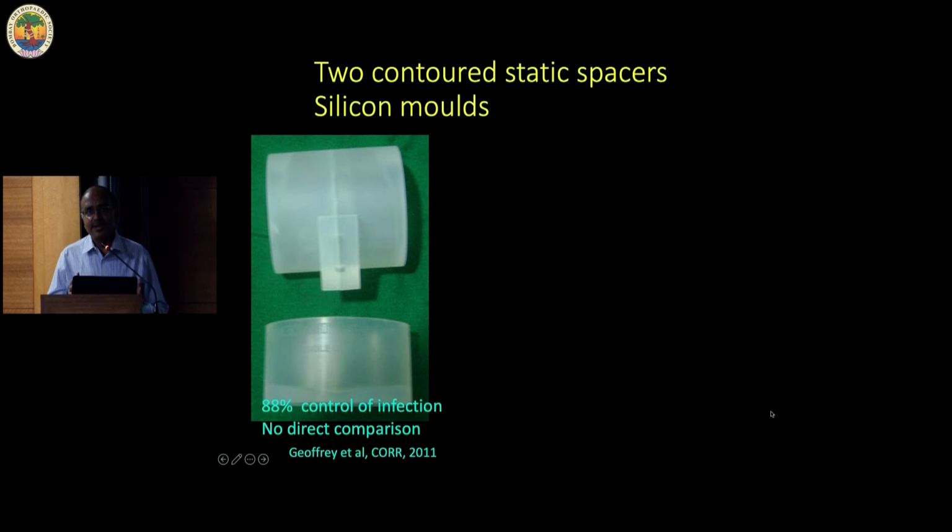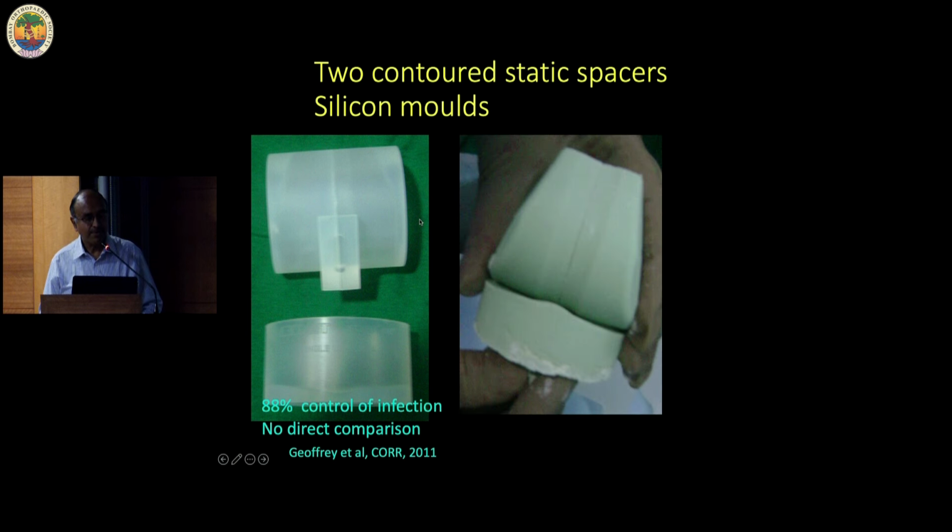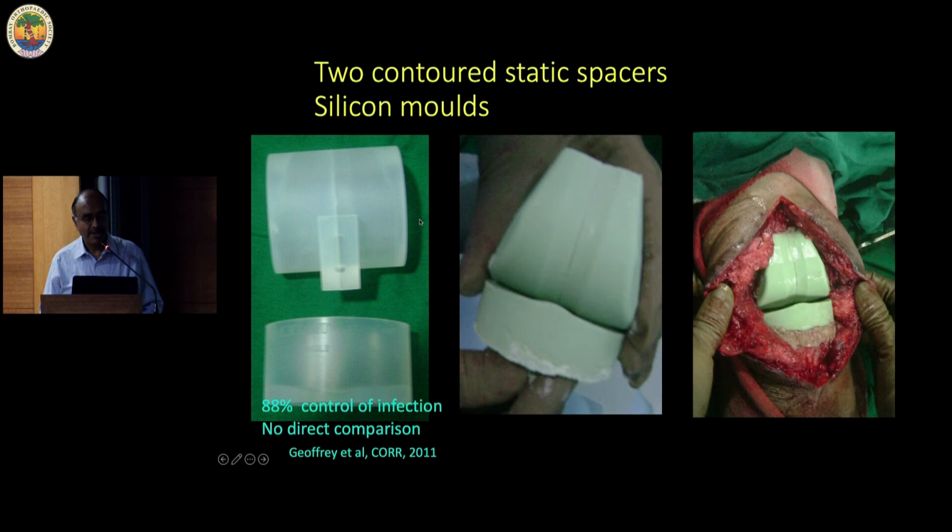Since these are primary native knees, here the cement spacer should be a cruciate retaining type of spacer. There are Biomet kinds of templates available, where you prepare the cement spacer like this and put it like this. The advantage is that you do not open the medullary canal, hence you prevent the spread of infection inside the intramedullary canal. So you just take the bone cuts, the distal femoral cut, AP cuts, and the chamfer cuts using an extramedullary jig rather than an intramedullary jig.